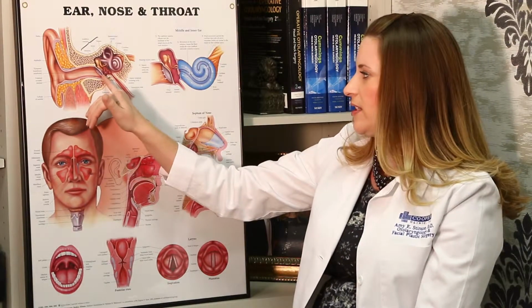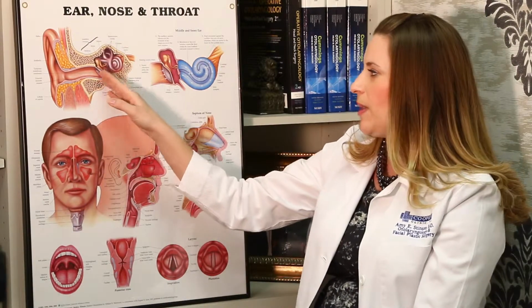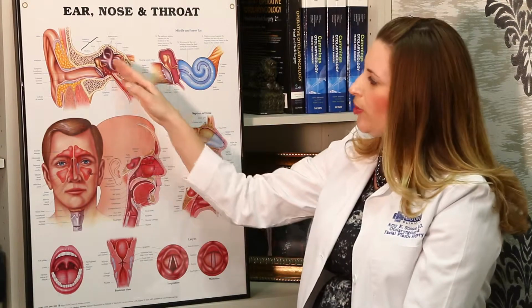We then place the ventilation tube through this incision site once all of the fluid has been removed from that middle ear space. The ventilation tube is very small. It's only about the size of the tip of a pen, or a few millimeters across. This is enough to allow ventilation in and out of this space to help this eustachian tube recover and mature.